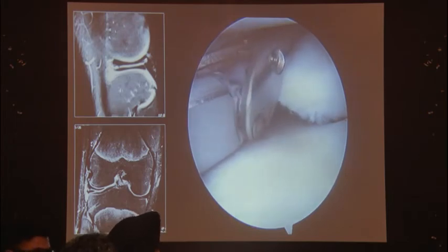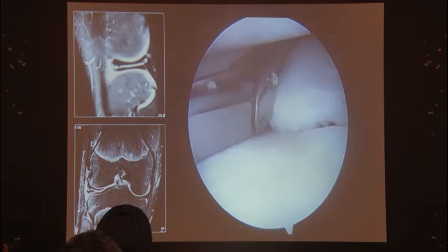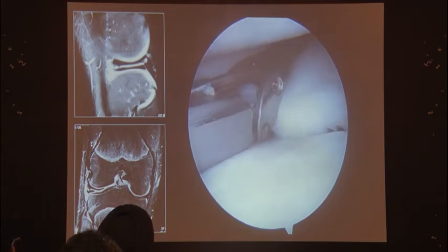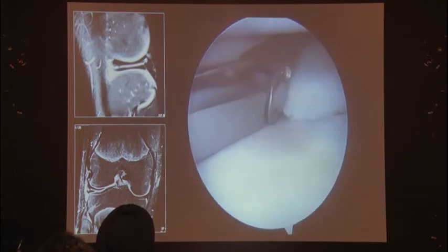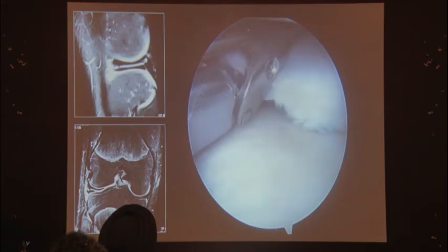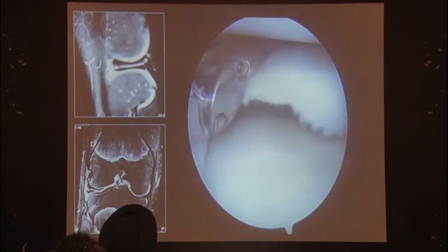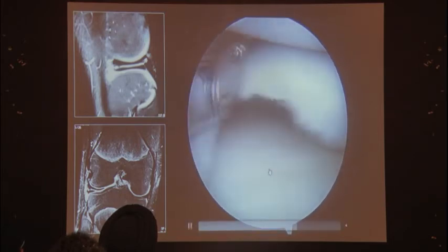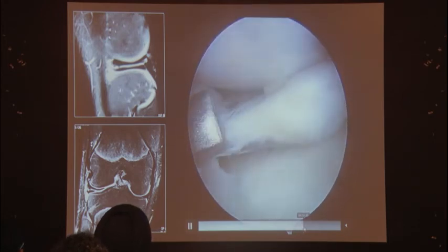Once you've gone through both leaves of the horizontal cleavage tear, you can compress them. This is the circumferential compression suture that goes all around the meniscus. You check the black line to see where it's going to come out, pass the first suture through, then slide to the side. A useful trick: you can get two sutures out of one cartridge when doing a horizontal cleavage tear, saving the patient money. You then pull off both sutures.